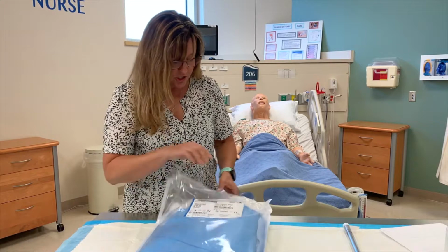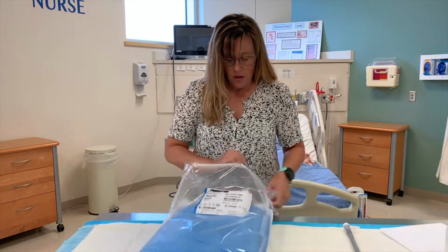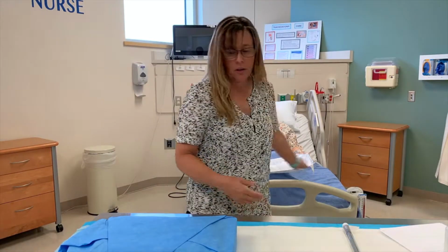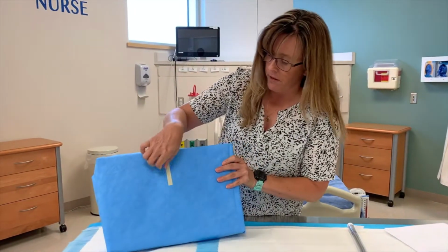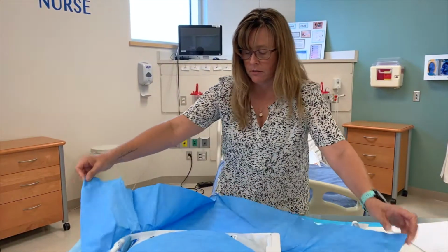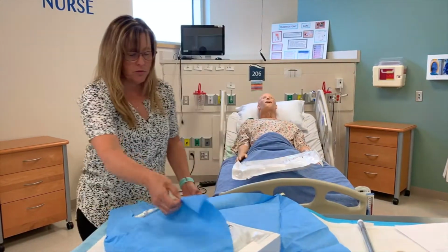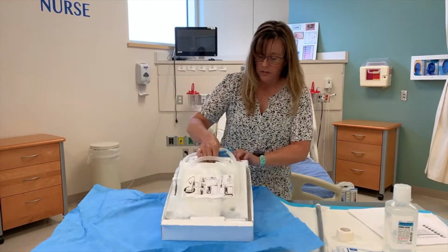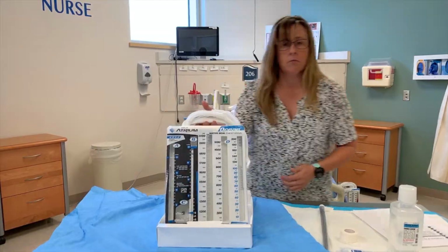Once you open that chest tube kit up, I know it looks like it's going to be a sterile type of procedure. What you'll do is open it up, usually tape the bottom, open up your actual kit, and then make sure, so when you take your actual kit out, it's going to look much like this.